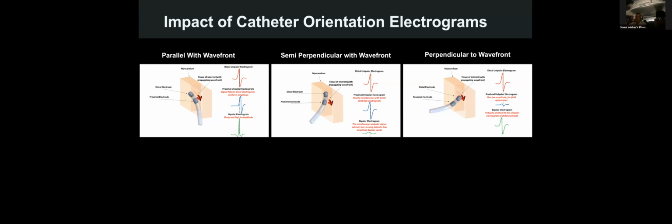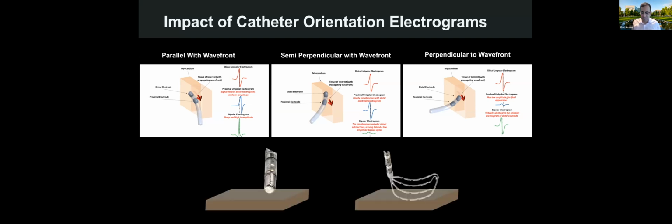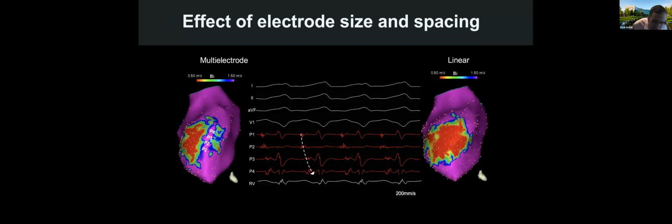Like if you have an electrogram, if you have a surviving myocardial bundle there, why is a bigger electrode not going to detect it? I think it does, but in many ways it has to do with the relationship between M1 and M2 and how they're being canceled. And this is to make this point. Okay, but I'm not here to talk about resolution, it's mostly about VT.